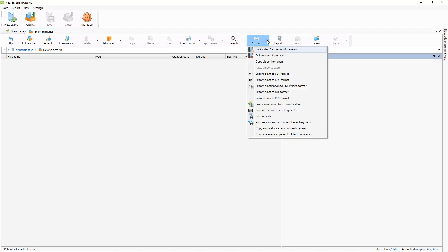And here in the actions button you can see a list of commands which you can do with the selected examination directly from the exam manager window.